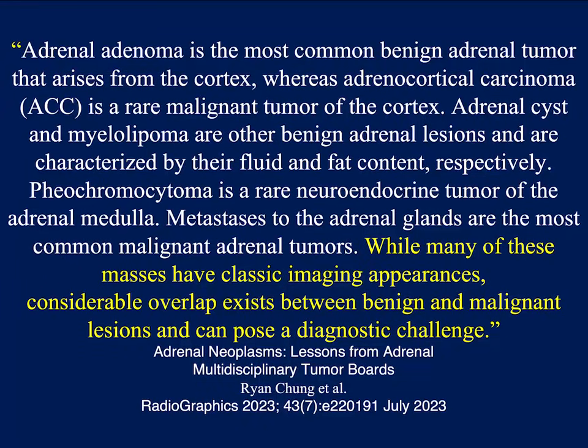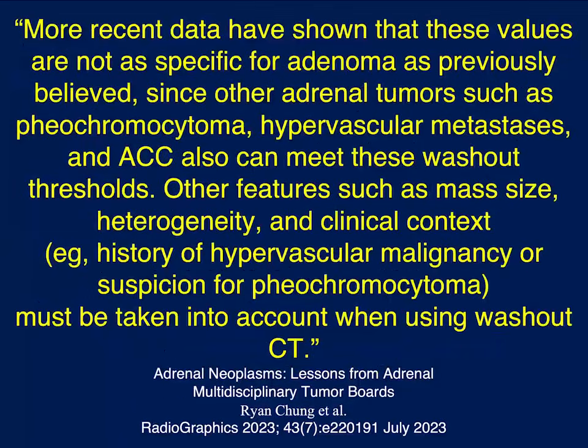But when you get down to it, we have adrenal conference every other Friday, and you would think, based on all of the rules to date and all of our experiences, it would be very simple to make diagnoses. But I'm telling you that the overlap between benign and malignant lesions poses a diagnostic challenge, which we have to deal with literally on a weekly or biweekly basis. In that article by Chung, more recent data has shown that values are not as specific for adenoma as previously believed, since there is overlap with other tumors.